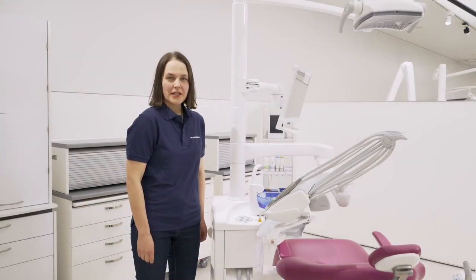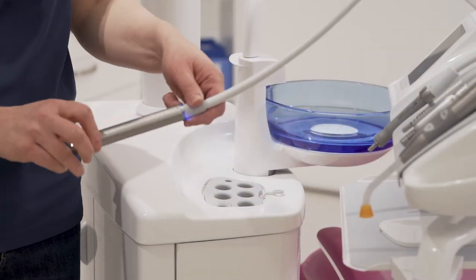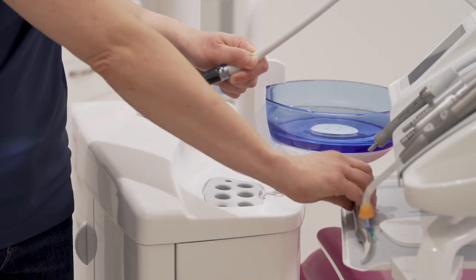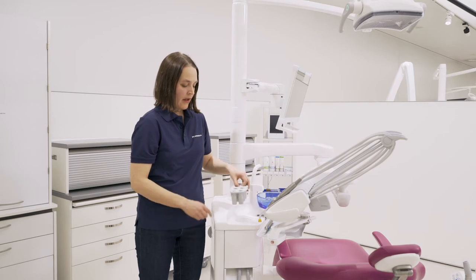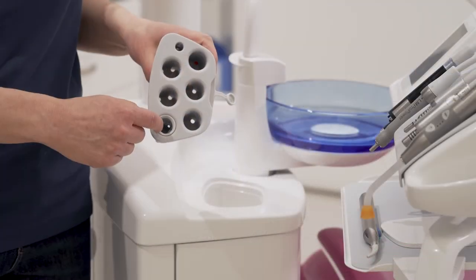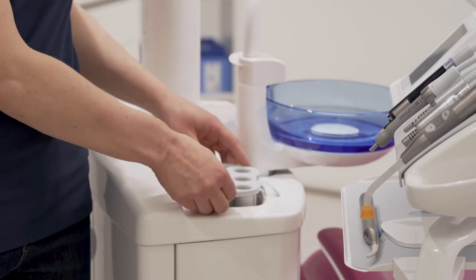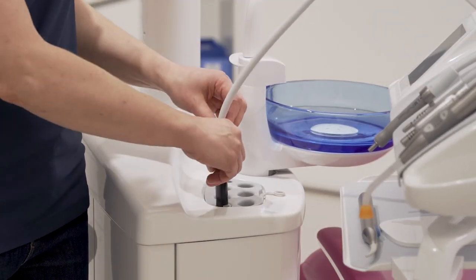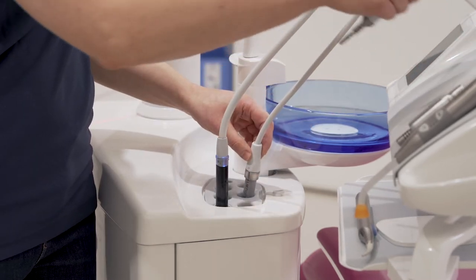When you place instruments into the instrument flushing holder, remove the syringe cover. The syringe must be placed into its dedicated opening. The other instruments you can freely place into the other openings.